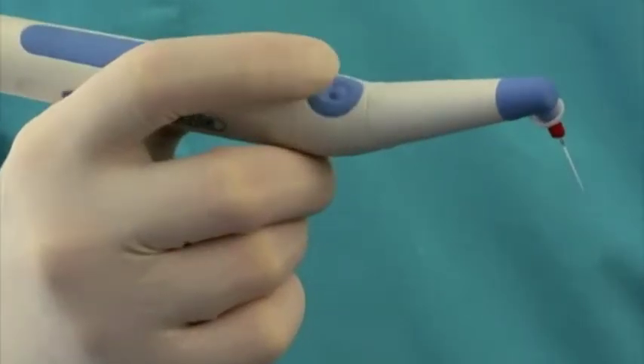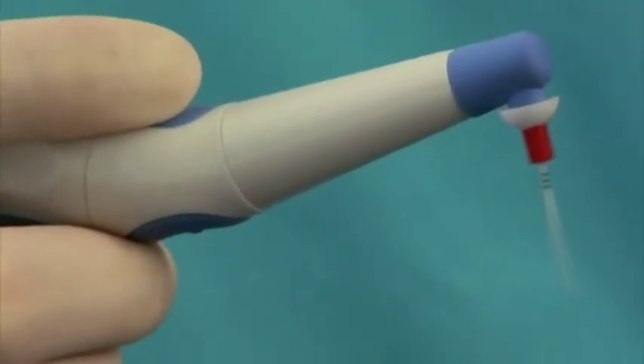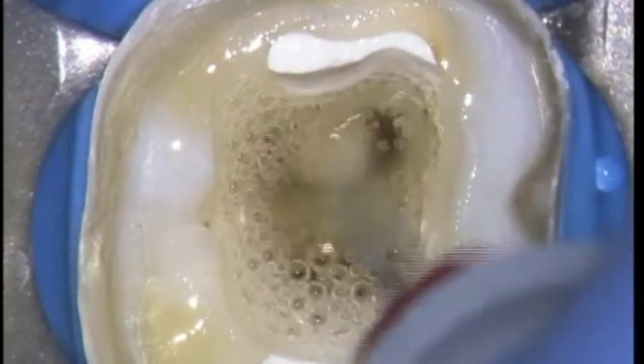When the driver is activated, the power defaults to 10,000 cycles per minute, which is the recommended speed to maximize debridement and disruption of the smear layer and biofilm. The other speeds are selected based on different applications and the power needed to effectively accomplish the clinical task.